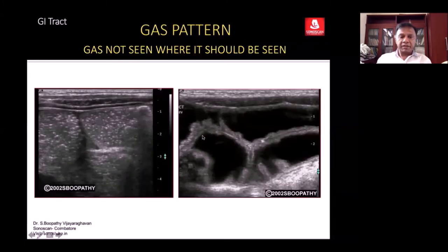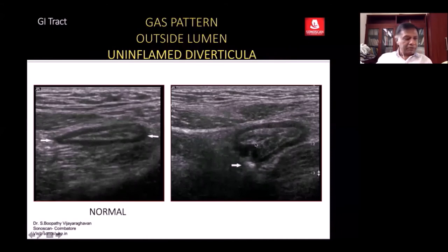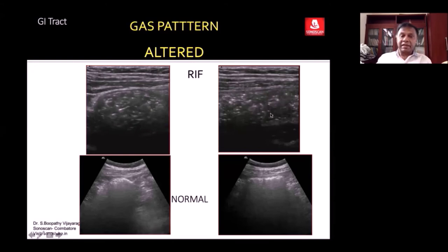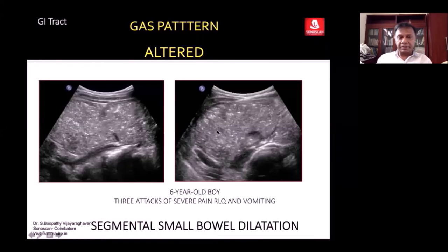In contrast, you see dilated small bowel loops, but what is lacking is gas bubbles. In the right iliac fossa, you see a dilated loop filled with fluid and microbubbles on long axis scan — a dilated featureless bowel — indicating ileum rather than cecum, confirming small bowel involvement, which shows peristalsis.